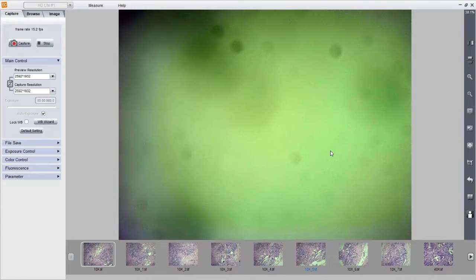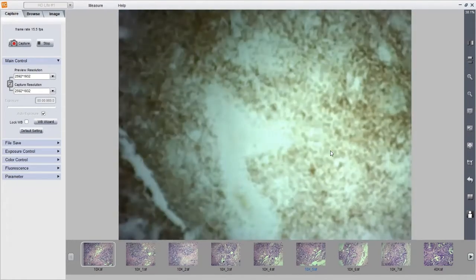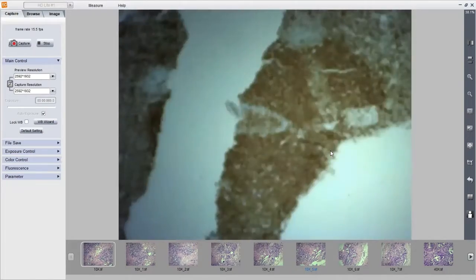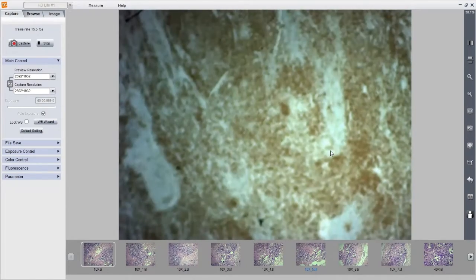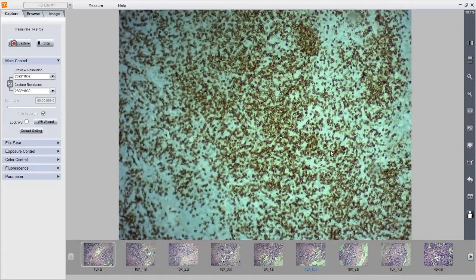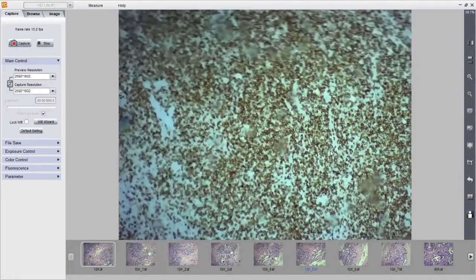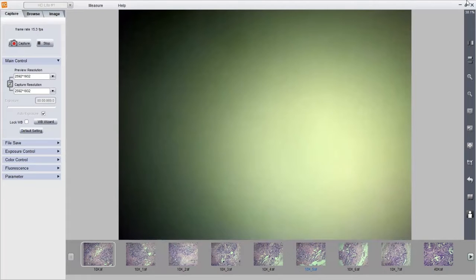CD3. I told you, classic Hodgkin lymphoma. The background is T cell rich. I'm constantly emphasizing this because when we come to NLPHL, the background is quite different. Here the background is T cell rich. So that was about mixed cellularity Hodgkin lymphoma.